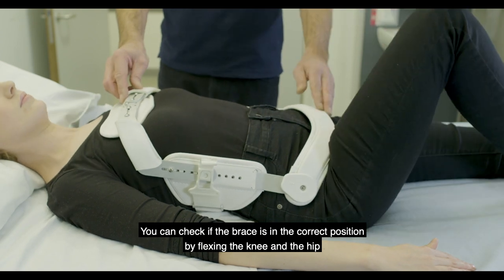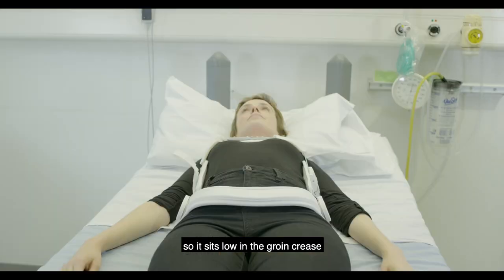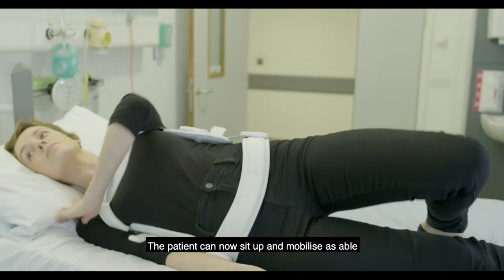You can check that the brace is in the correct position by flexing the knee in the hip so it sits low in the groin crease. The patient can now sit up and mobilise as able.